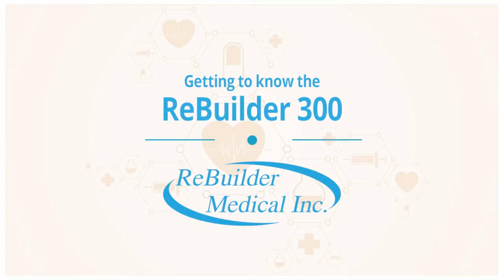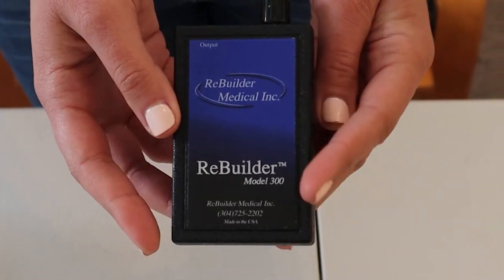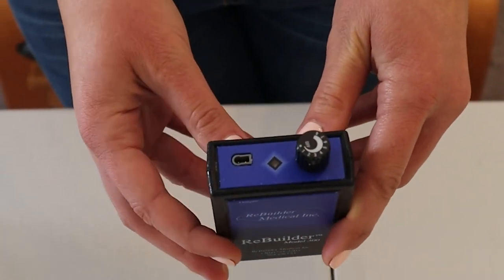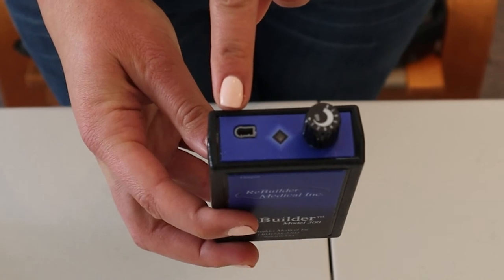Getting to know the Rebuilder 300. The Rebuilder 300 has one output to operate one set of lead wires.